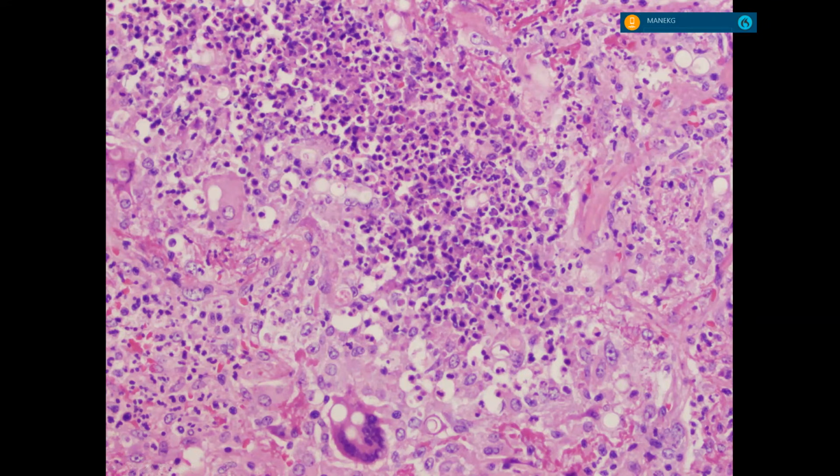Yes, it would be, but there's something you're missing in this. It's a lot of vacuole-like substances. Yes, vacuolar. What are those vacuolar substances? Foamy macrophages. I'll point to a few. There's that. There's this. There's this one here. Could it be fungus? I'll give you a stem, okay?